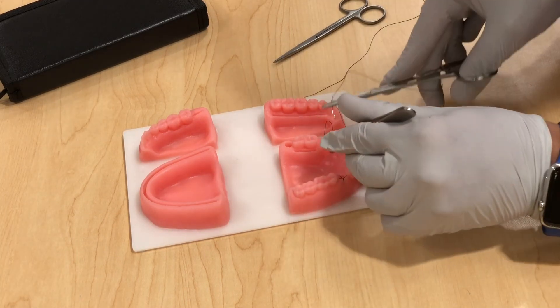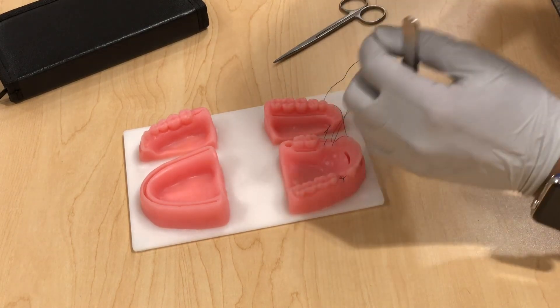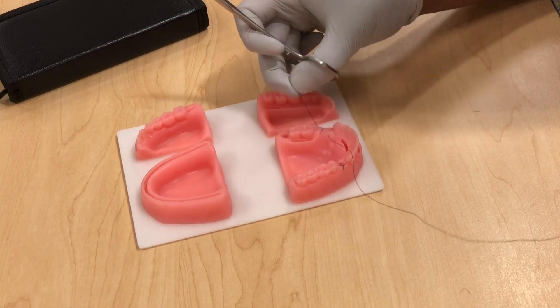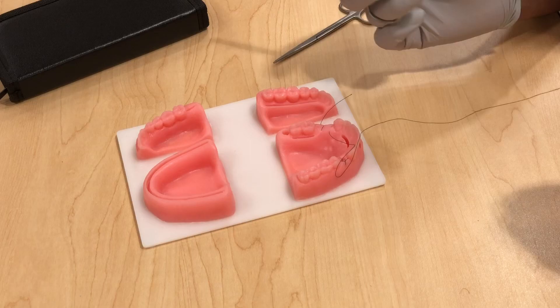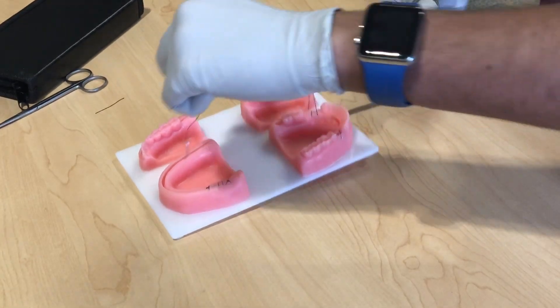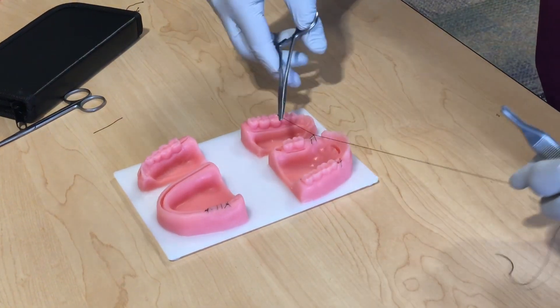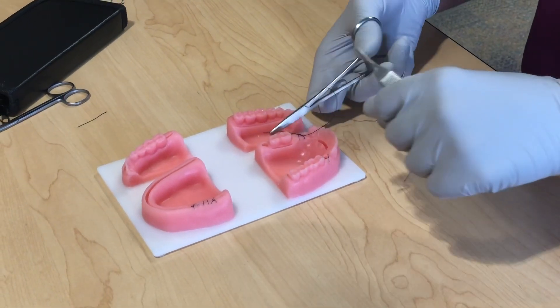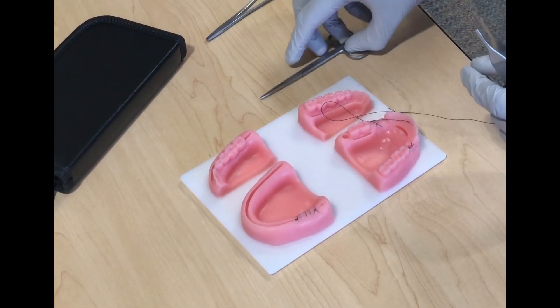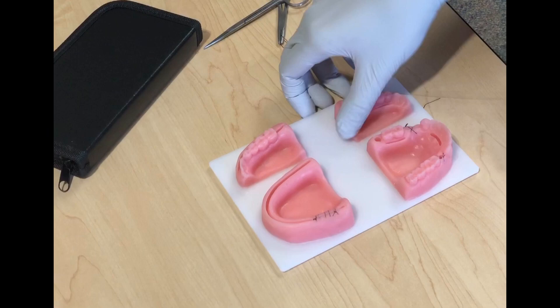Apply the same principles holding the tissue. Just like what we did for the simple interrupted, do two loops toward the short end, then go and grab it and pull across. Do a single loop toward the short end and pull across. Do one last loop toward the short end, pull across, then cut it. There you have it — that's why it's called figure of eight, because it looks like an eight.